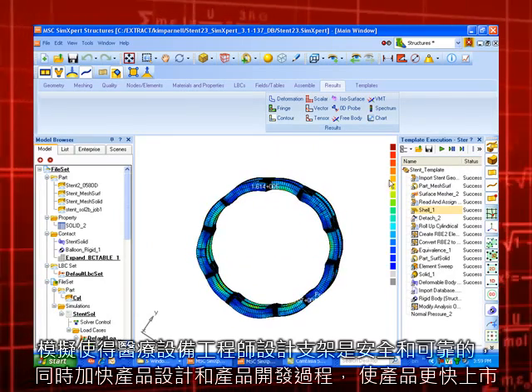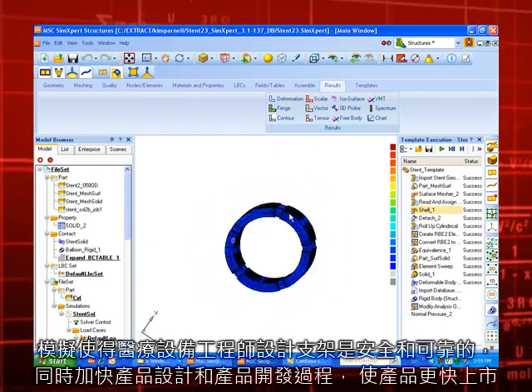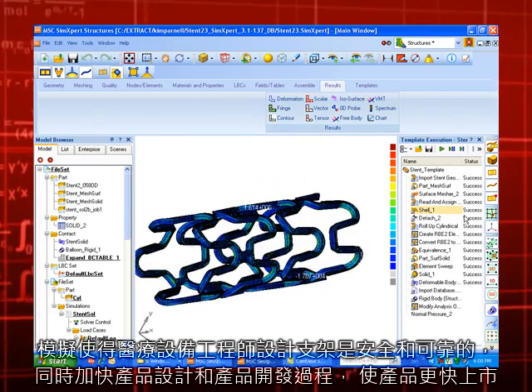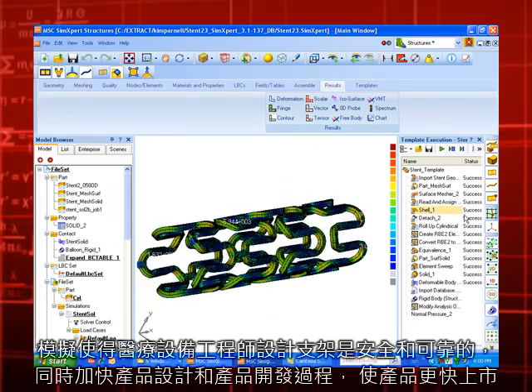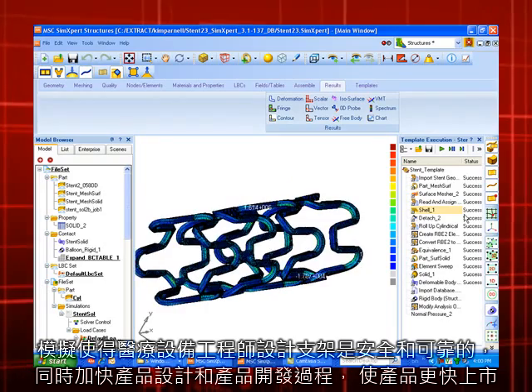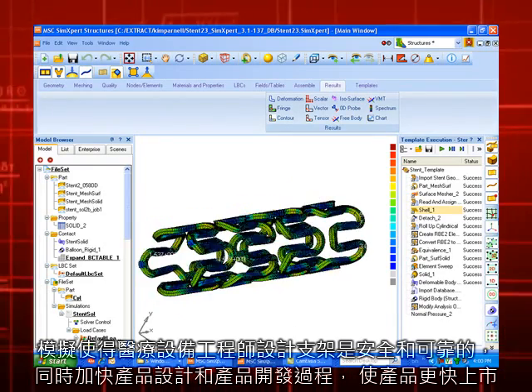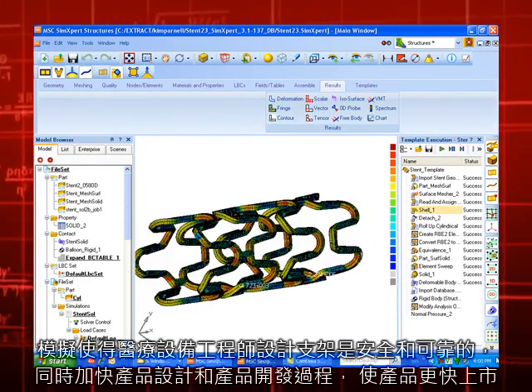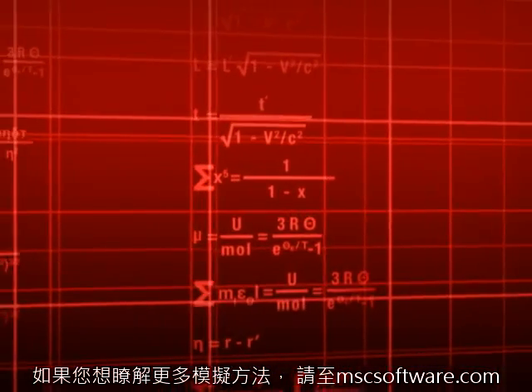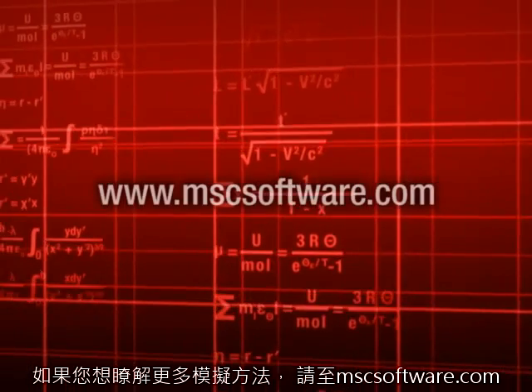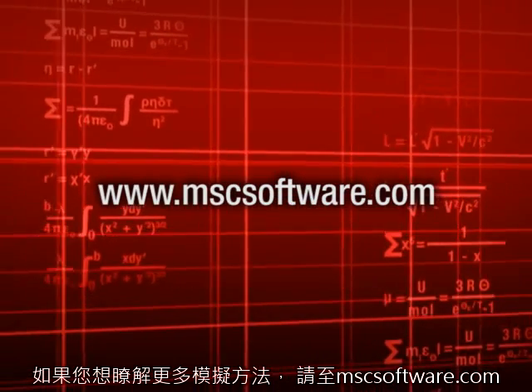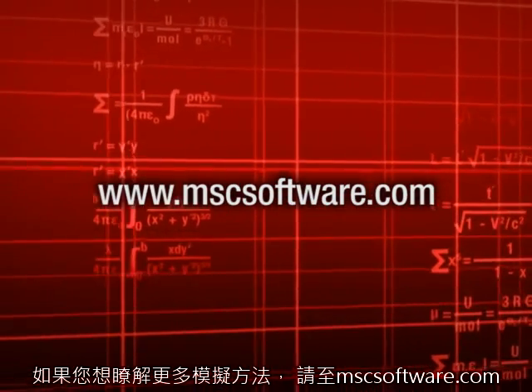Simulation makes it possible for medical device engineers to design stents that are safe and reliable, and accelerates the design and product development process to get products to market faster. If you'd like to learn more about how simulation can be used, please go to mscsoftware.com.